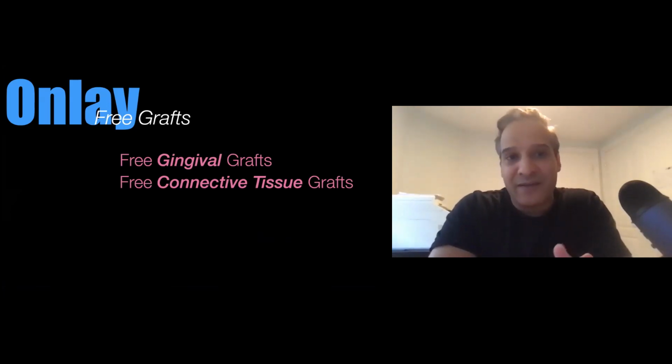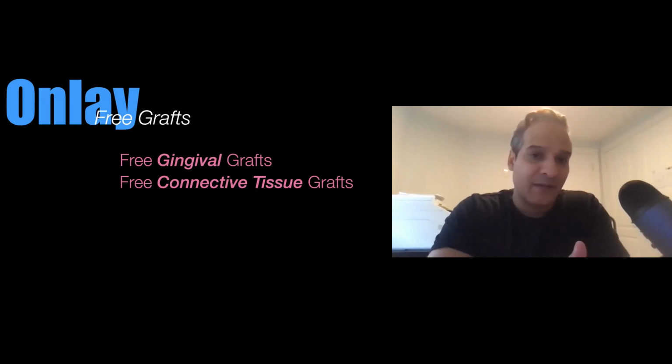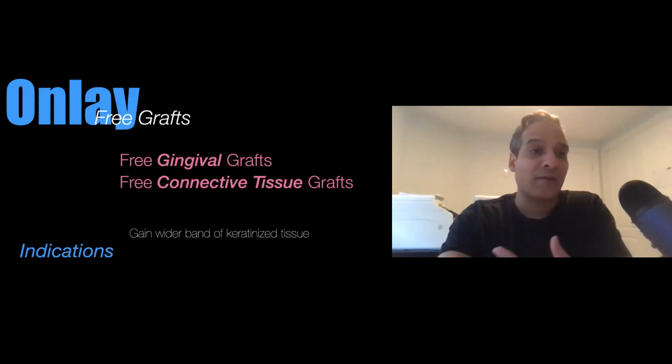Now, onlay grafts or free grafts only receive their blood supply from the base. So you have to make sure that when you do these, the suturing and the compression and the dead space is all removed so that there's no interruption of the blood supply. Now, what most people don't know is that onlay grafts can be either connective tissue grafts or free gingival grafts. They both work the same way because the genetic component to making keratinized tissue is in the connective tissue, not in the epithelium.